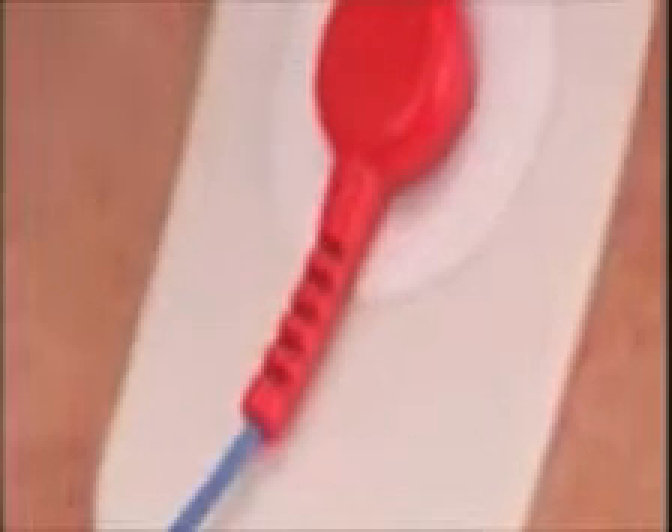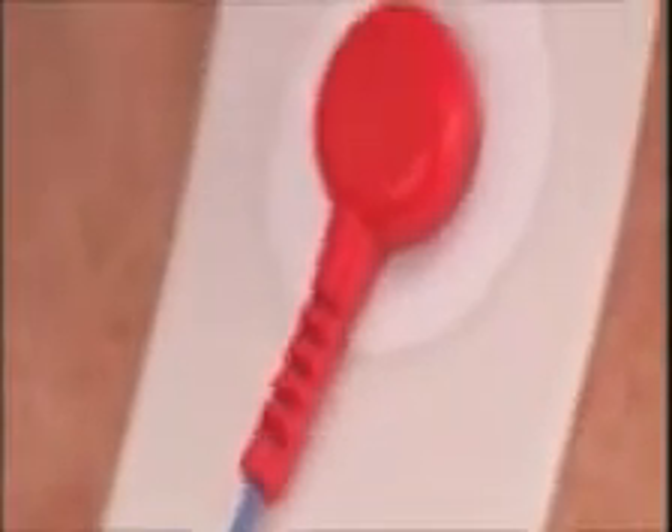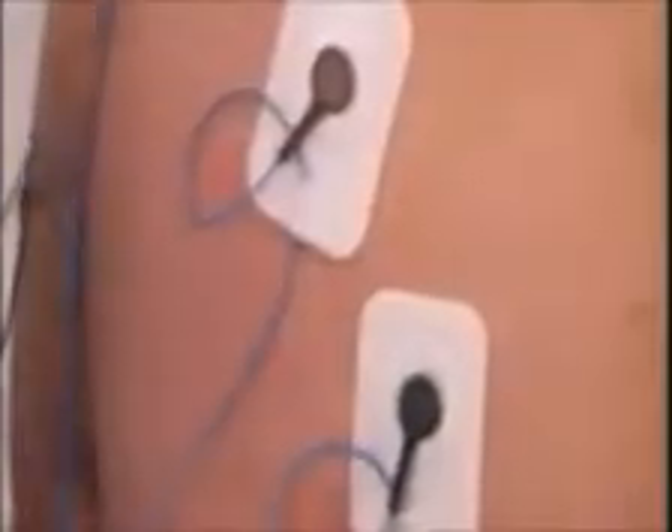Here are some tips for optimal electrode hookup. It does not matter which way the electrode is pointing. Each electrode has a small slit on the bottom left side of the electrode to allow you to create a stress loop. Adding the stress loop at each site will lessen the chance of the wire disconnecting from the electrode due to movement and reduces artifact if the leads are pulled or tugged during normal patient activity.